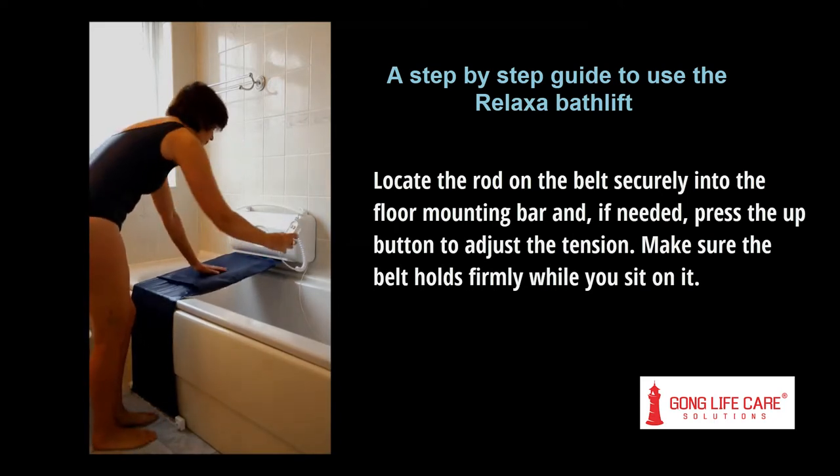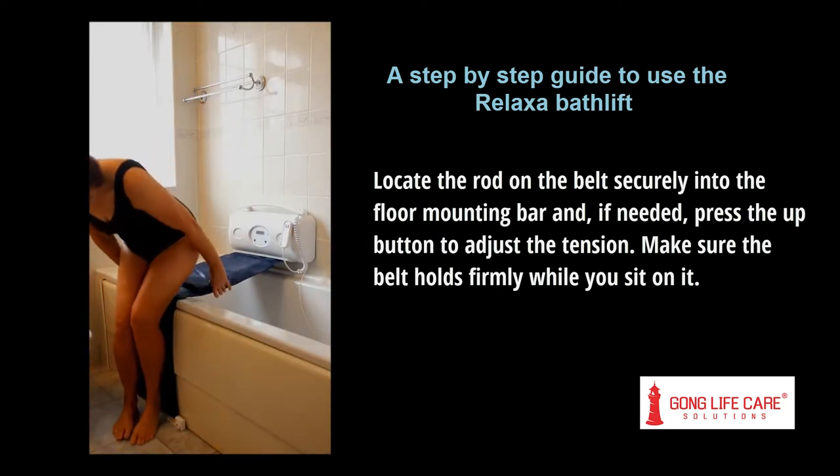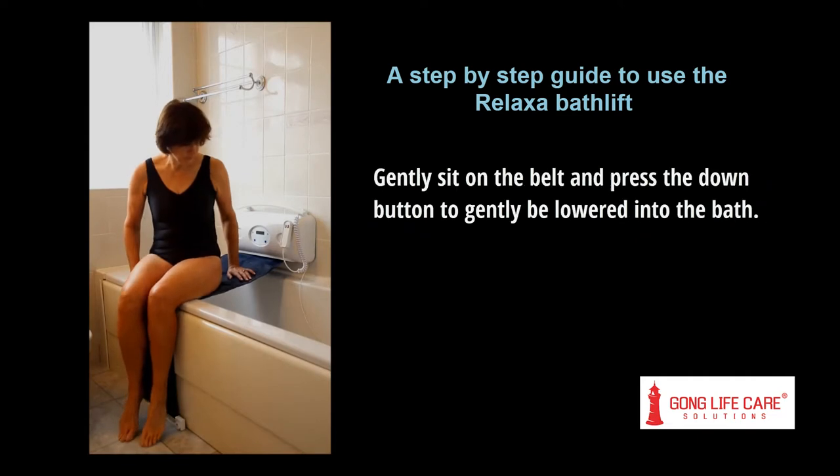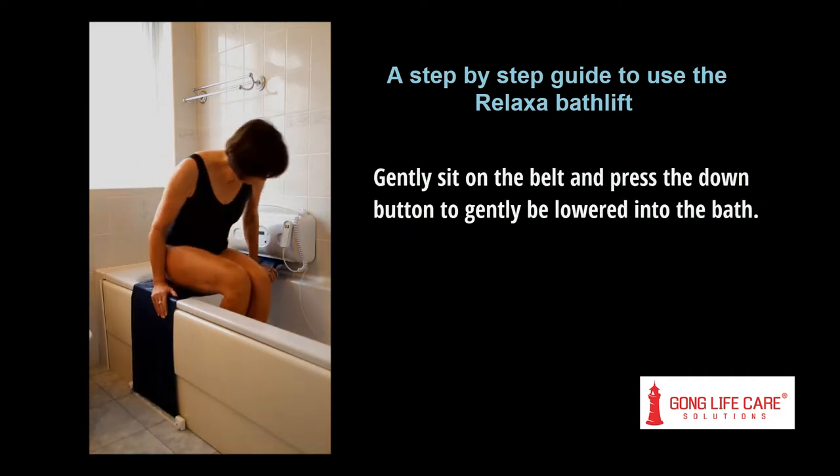Make sure the belt holds firmly while you sit on it. Gently sit on the belt and press the down button to be gently lowered into the bath.